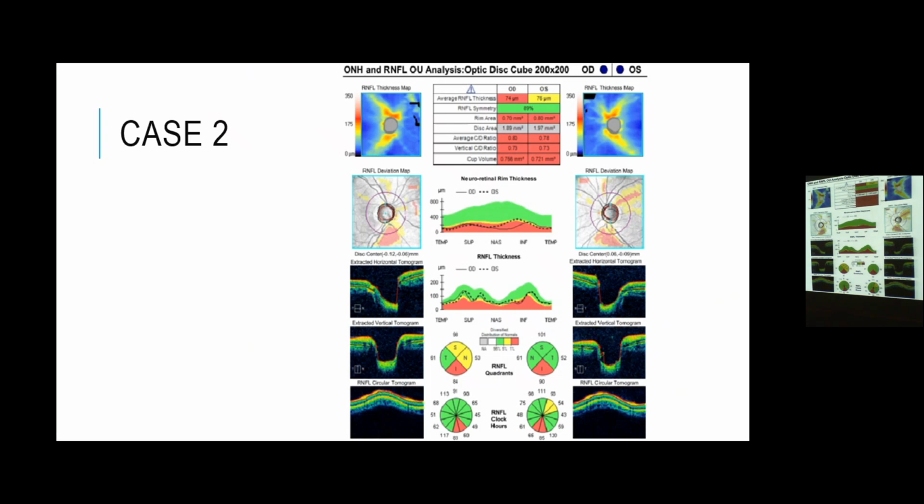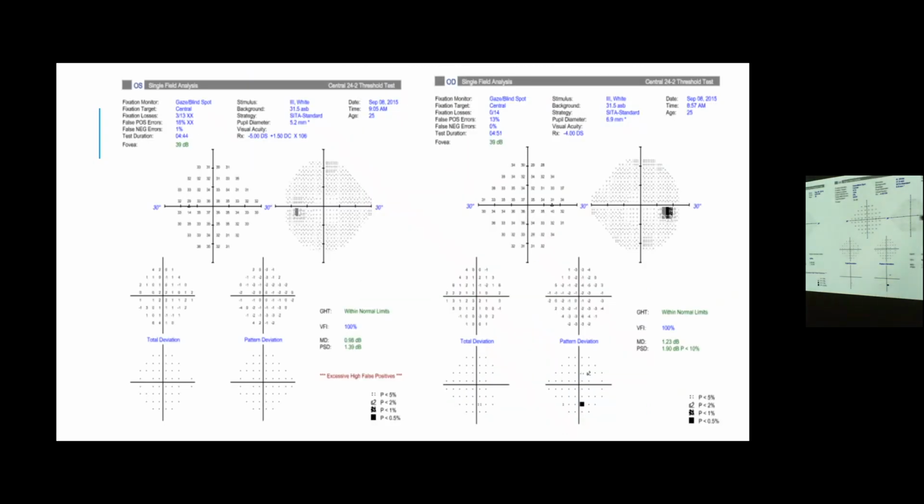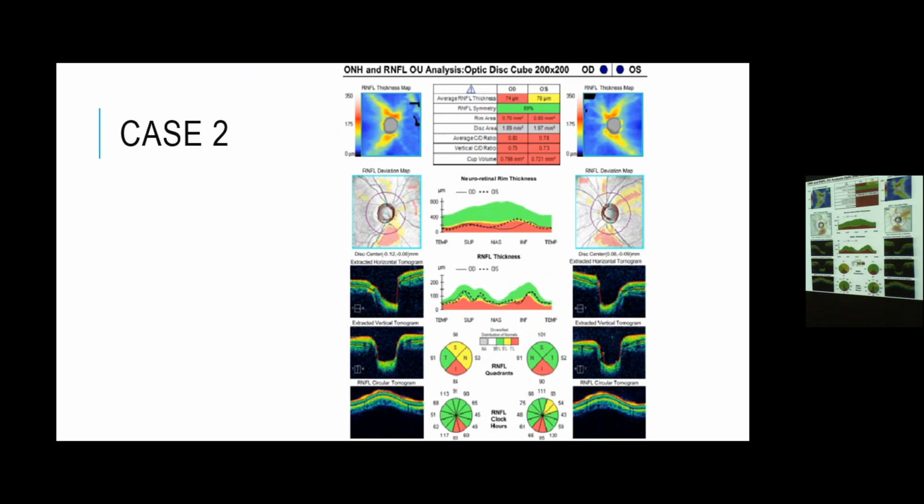There is a gradual decrease in the thickness with age normally, thinning with age. We said there is symmetrical thinning. If there is symmetrical thinning, okay, it's either physiological or symmetrical glaucoma, which is unlikely.